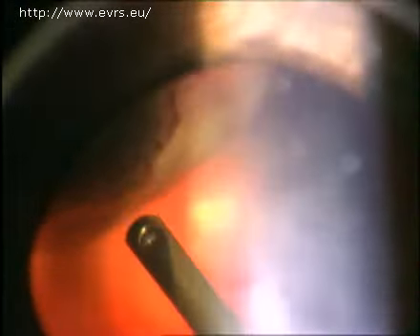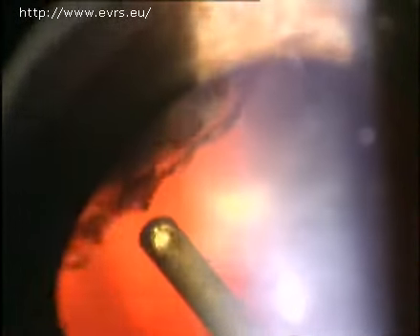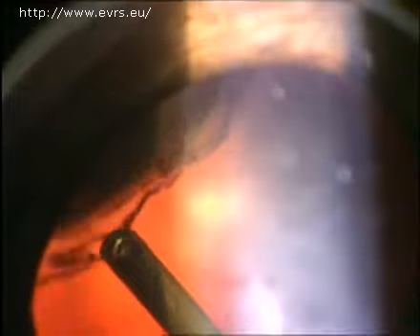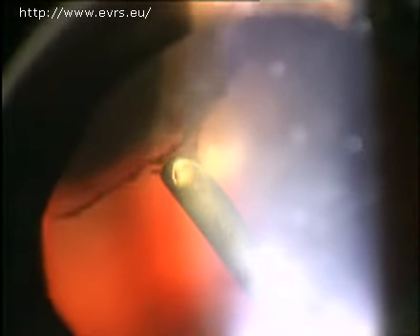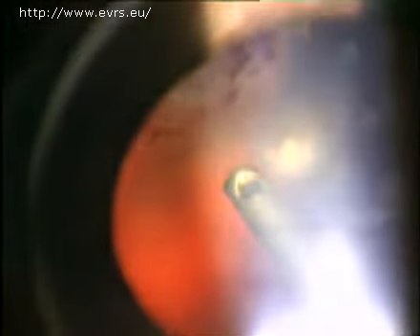The problems are that we are working in a complex environment with varying viscosities, and that the machine is not intelligent. It can only respond to our commands while also obeying the laws of physics — in this case, the laws of fluid dynamics.